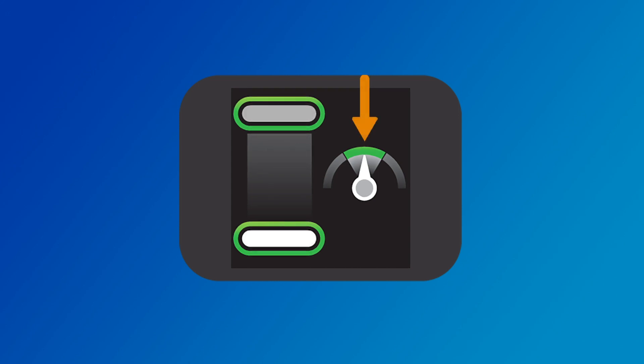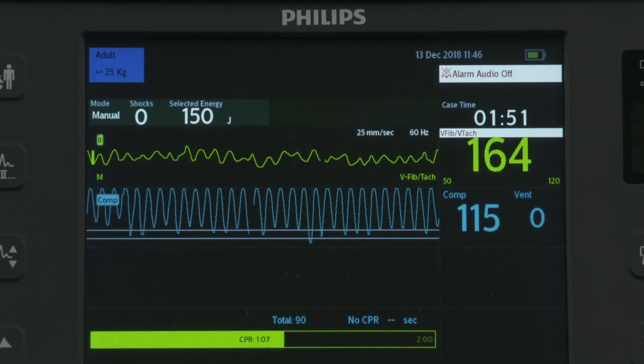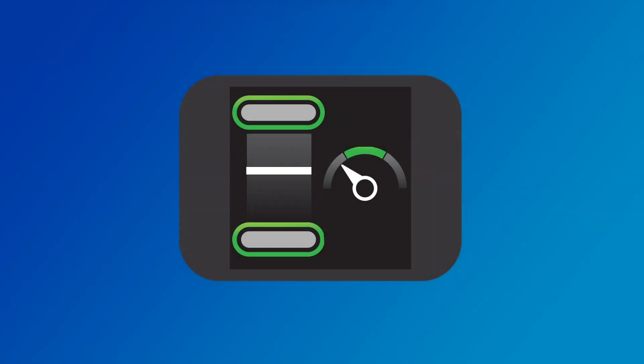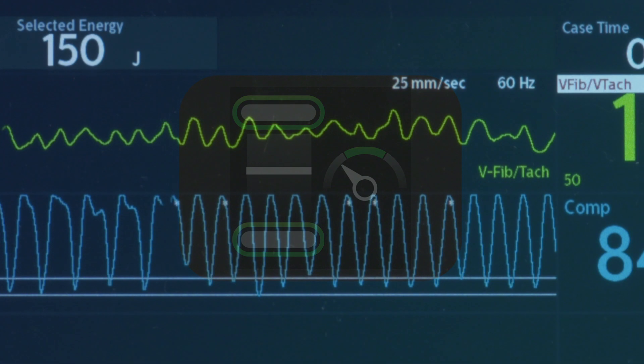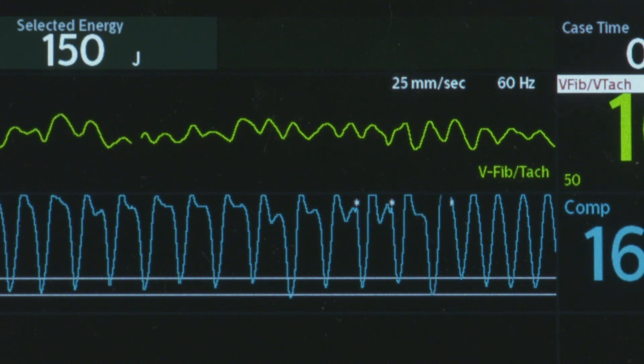If the CPR meter detects the compression rate is within the target area, the speedometer needle on the compression rate indicator points to the green target zone, which lights up. If the compression rate is faster than the target rate, the needle points to the right of the green target zone. If not corrected, the HeartStart Intrepid provides a corrective voice prompt: "Compress slower." If the compression rate is slower than the target rate, the needle points to the left of the green target zone. If not corrected, the HeartStart Intrepid provides a corrective voice prompt: "Compress faster."